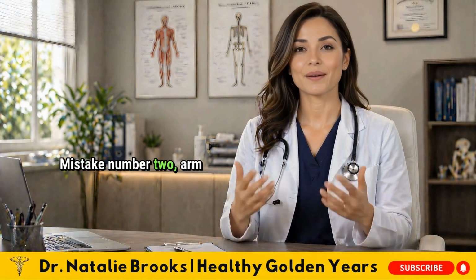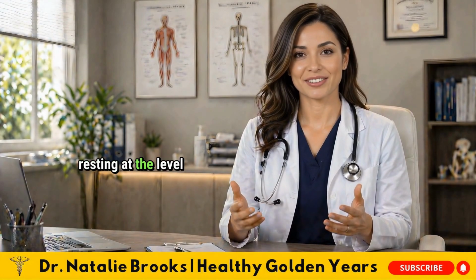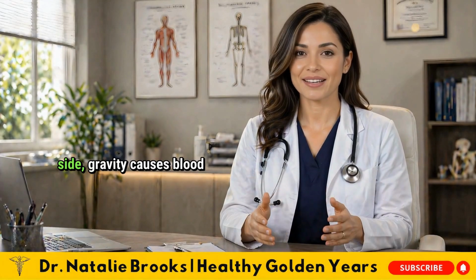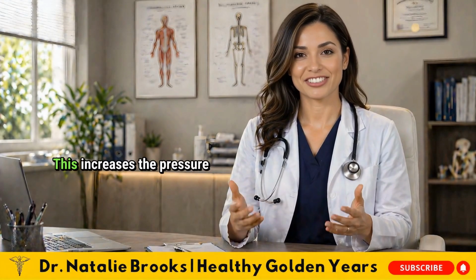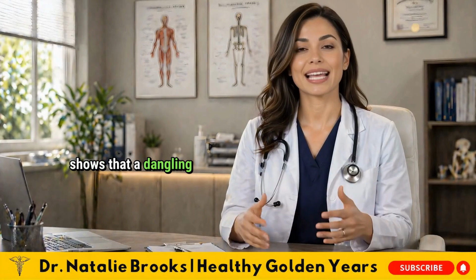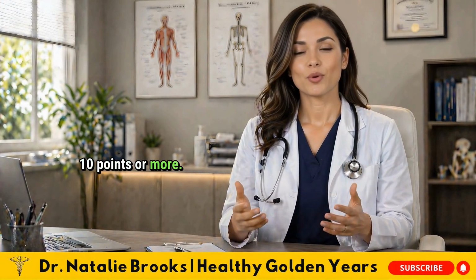Mistake number 2, arm not at heart level. Your arm must be resting at the level of your heart when you take the reading. If your arm is hanging down at your side, gravity causes blood to pool in the arm below your heart. This increases the pressure the cuff detects. Research shows that a dangling arm can artificially raise your systolic reading by 10 points or more.